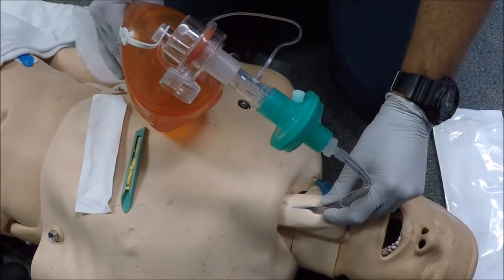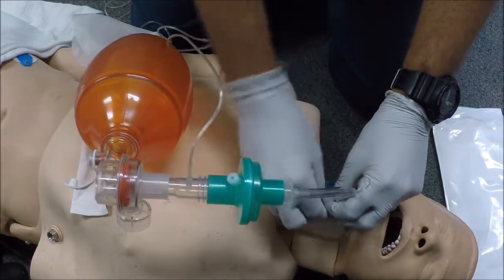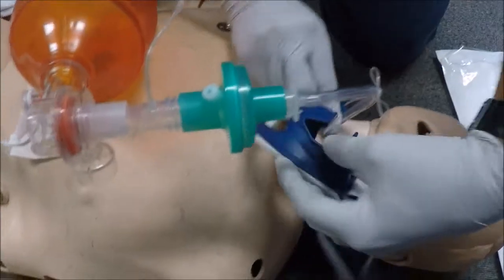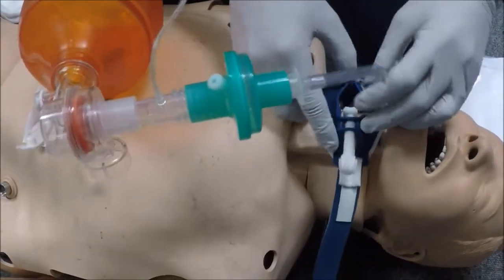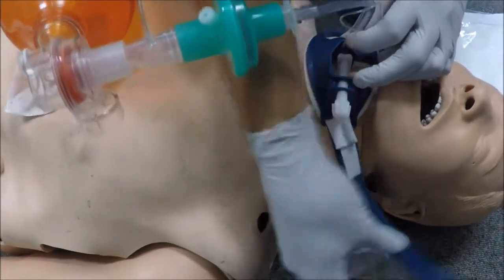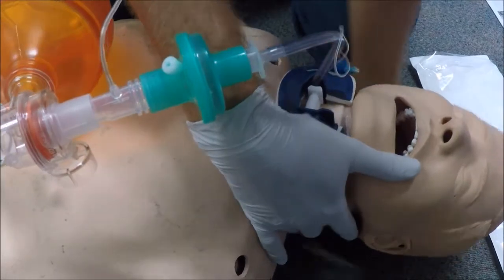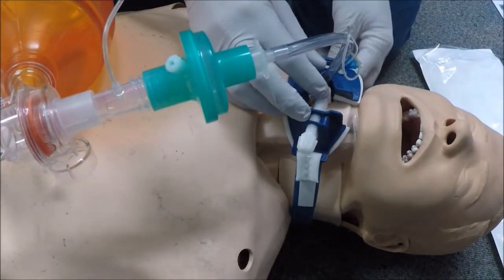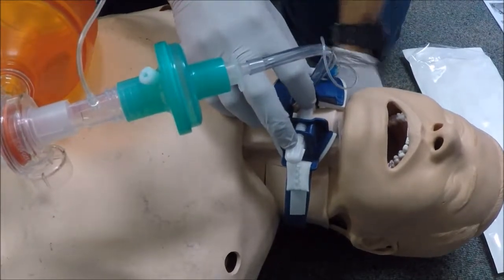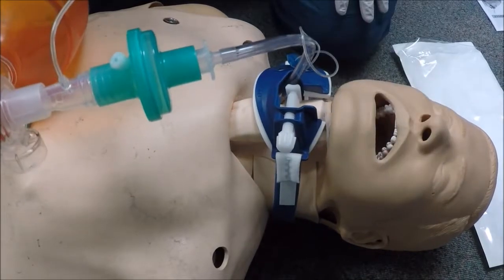And once we've confirmed positive placement and we get a positive capnogram, securing our tube, we can then use our Thomas tube holder to locate the cricothyroid tube in situ. And there we have the procedure of a surgical cricothyroidotomy.